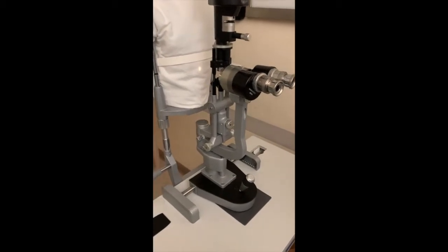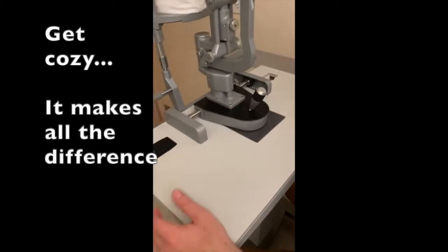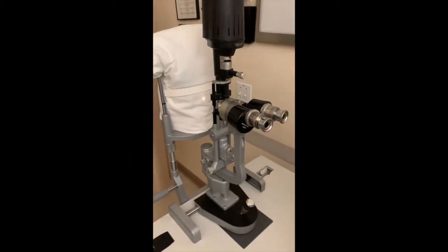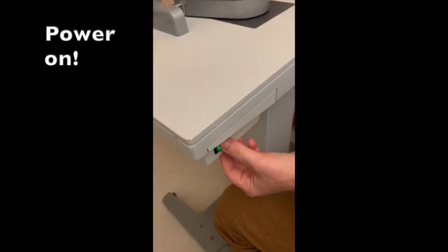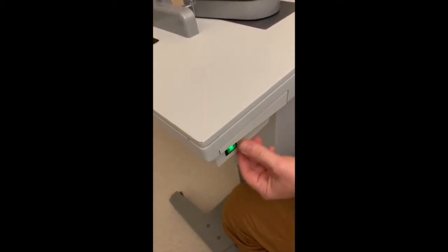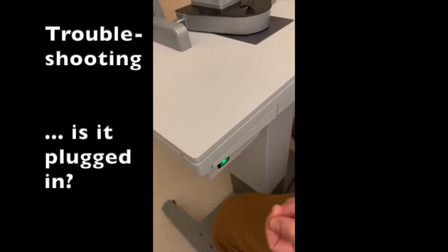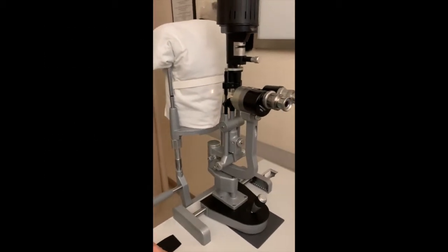The first thing you're going to do is sit down and make yourself comfortable and be at a comfortable eye level to look through. Second thing you're going to do is turn it on. And the on switch is usually on the base somewhere. Okay. The third thing you're going to do is adjust your intensity.